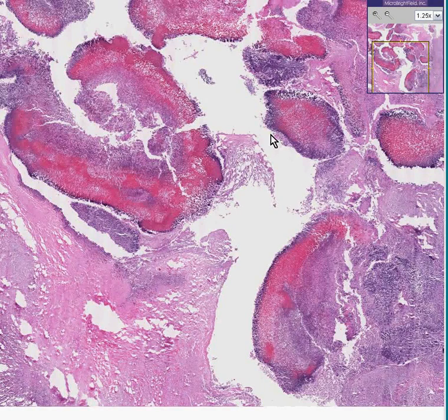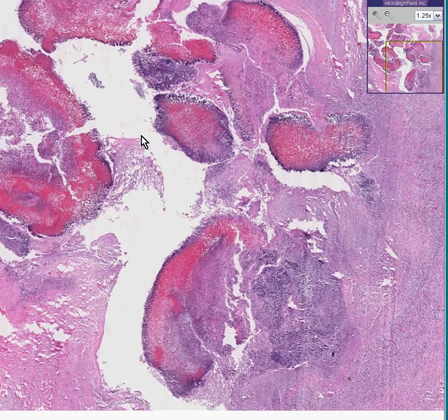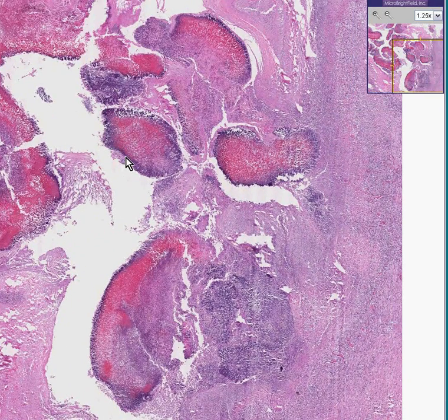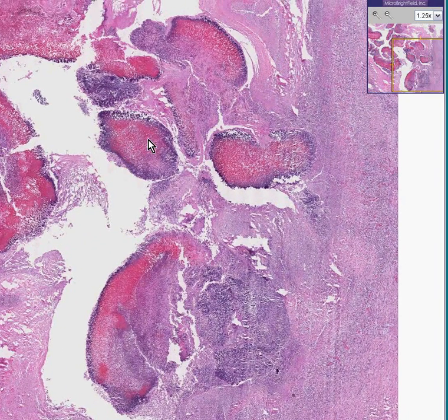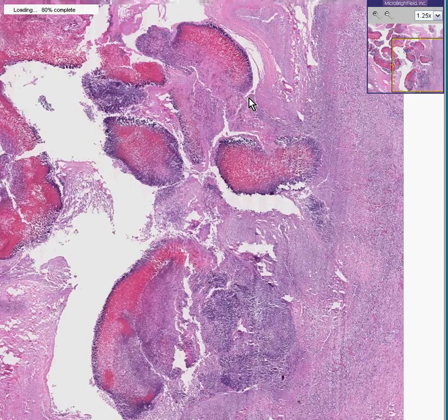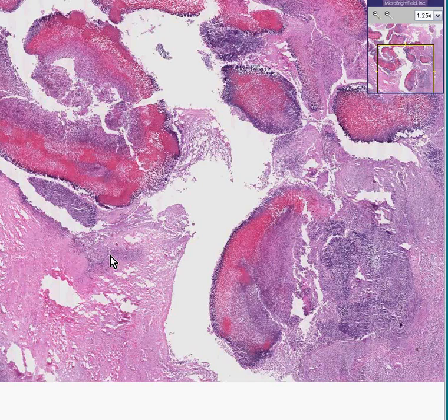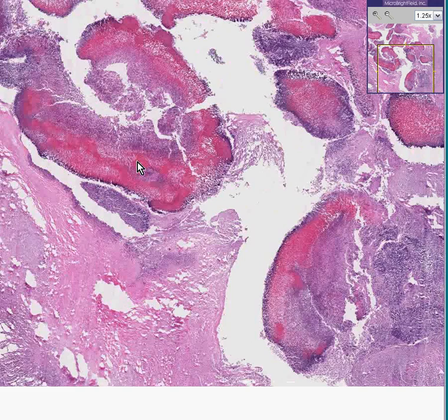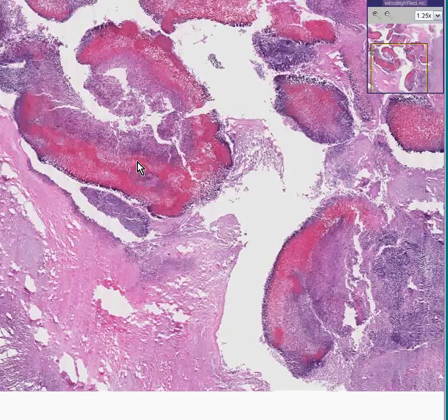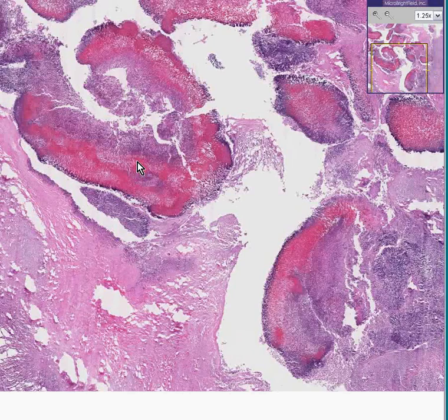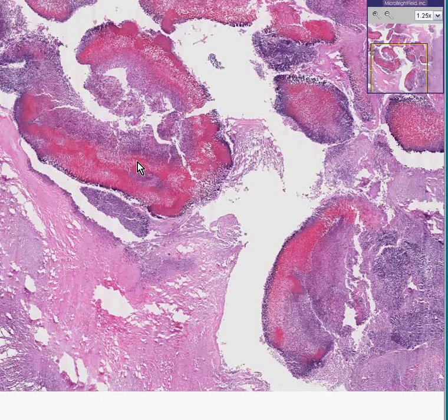If I told you that this slide here was taken from a lung, you would have every reason not to believe me because there is nothing on here that looks like normal lung. If I told you it was taken from an area in which the lung was totally consolidated and in addition looked like it perhaps had a more necrotic area centrally like an abscess, then you would believe me.